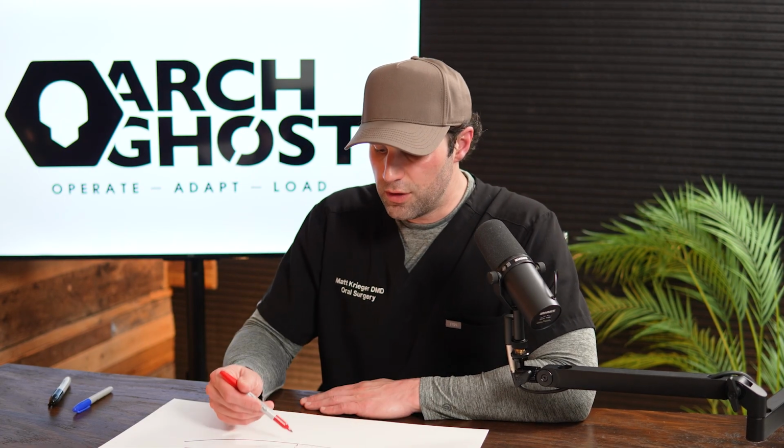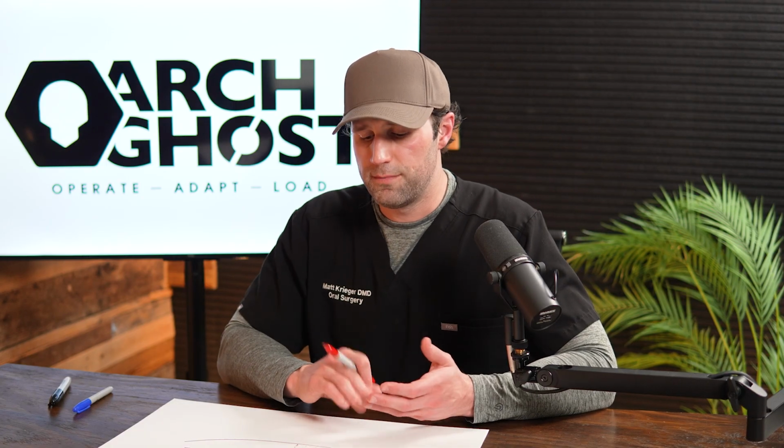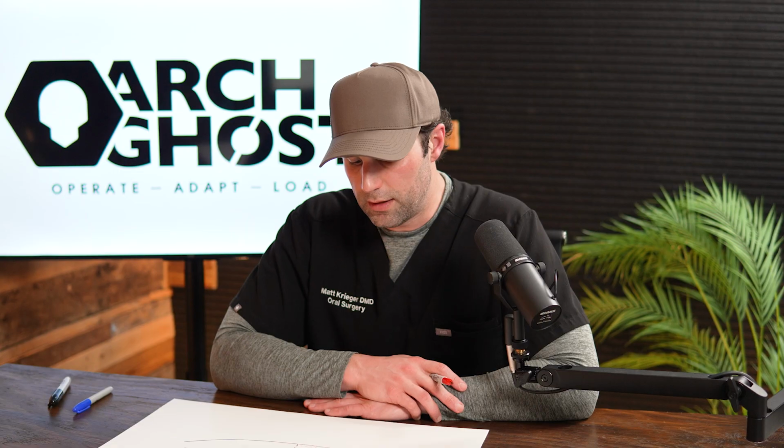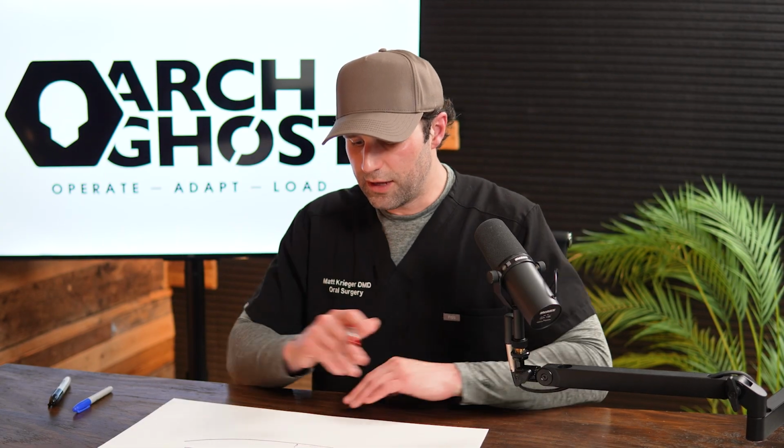So I use this to get me 90% of the way there, but I also clinically confirm with the feel of my drill and a perio probe placed in the osteotomy to make sure that I haven't popped into the sinus, okay? And maybe there are some times where that needs to be adjusted slightly, a couple millimeters one way or the other, but it's really pretty accurate. But again, I wouldn't just then blindly go and not pay attention to anything. You need to also confirm that location by clinical tactile feedback. But that's what I do.